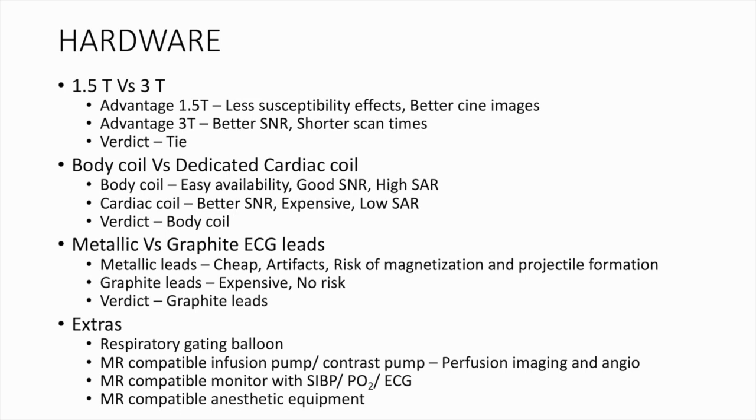The other hardware required are a respiratory gating balloon, an MR compatible infusion pump or contrast pump used for perfusion imaging and contrast enhanced angios, an MR compatible monitor with SIBP, PO2 and ECG monitoring facilities, and MR compatible anesthetic equipment, especially if you are doing stress examinations.